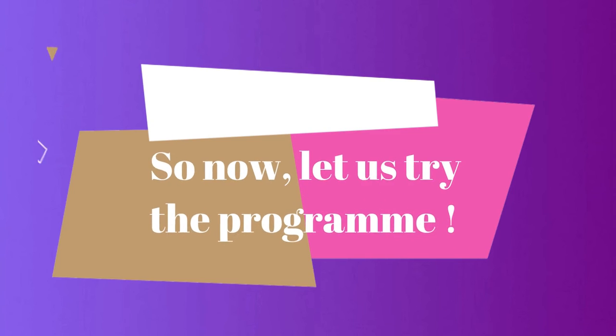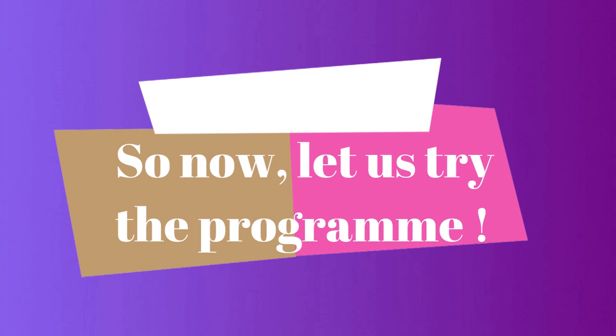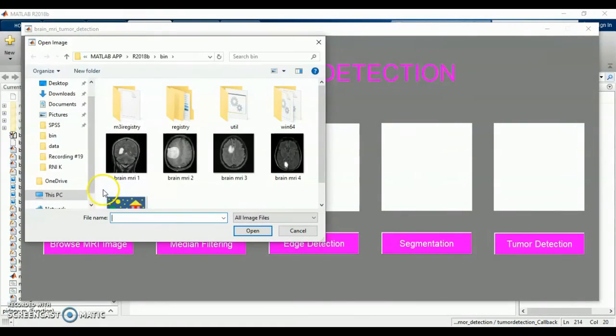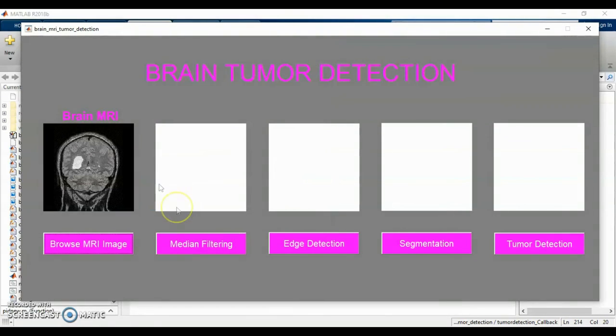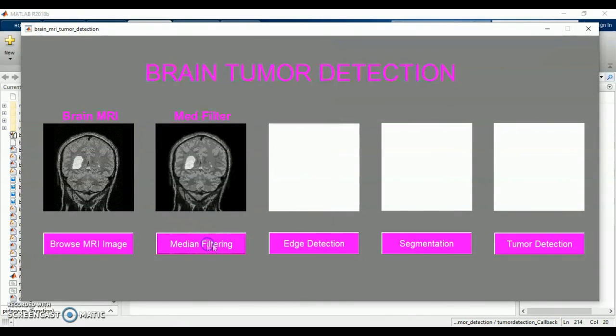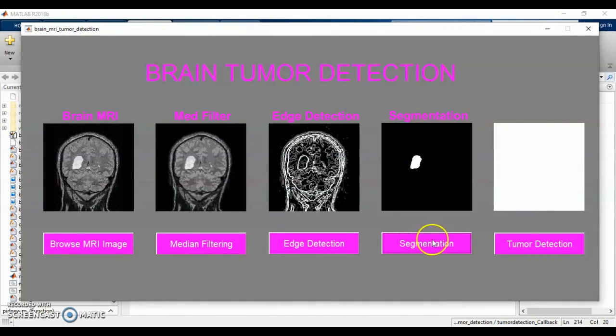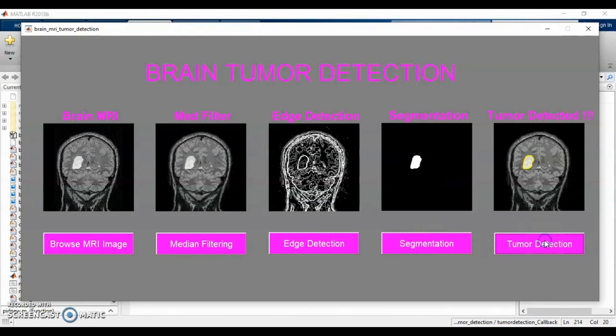Now, let us try the program. First, by clicking on the Browse MRI Image button, we can search for the MRI image that we want to analyze. Then, we get a second image with the noise removed by clicking on the Median Filtering button. Third, click on the Edge Detection button to get the image which shows the edge of the tumor clearly. Next, we can get only the tumor part by clicking on the Segmentation button. Lastly, we can get a brain MRI image with delineated tumor by clicking on the Tumor Detection button.